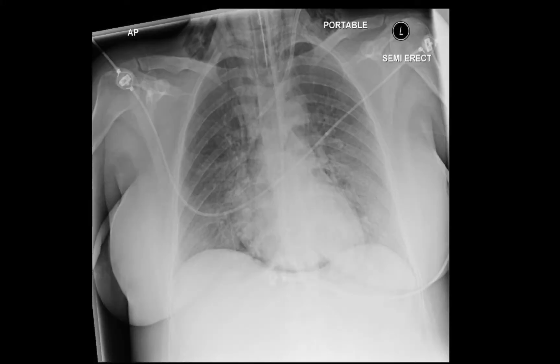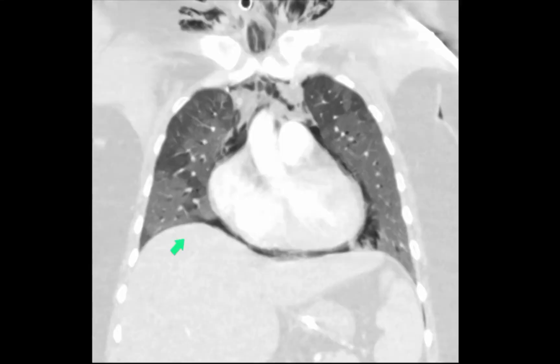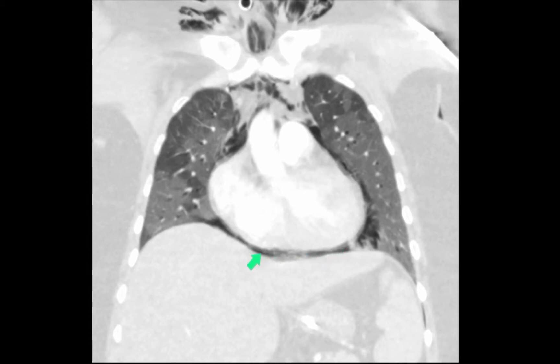Here's another ITU patient with surgical emphysema tracking via the fascial planes, with evidence of pneumomediastinum and the continuous diaphragm sign. This is the same patient on a coronal CT reconstruction, showing very nicely that gas gets trapped between the pericardium and the diaphragm, making the diaphragm appear continuous from left to right.